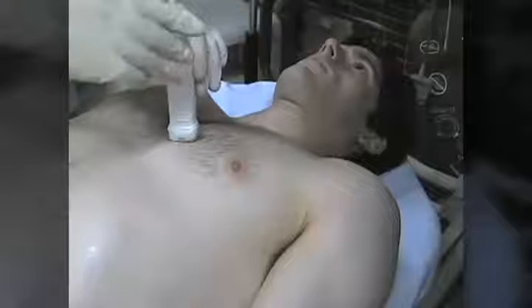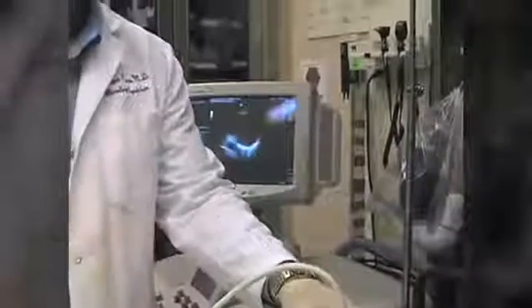Now, despite our best efforts, it can sometimes remain difficult to get good views of the heart from the parasternal position with the patient recumbent. So a pearl here is to position the patient in the left lateral decubitus position. Now this will pull the lung off of the heart and may improve our views from the parasternal position.